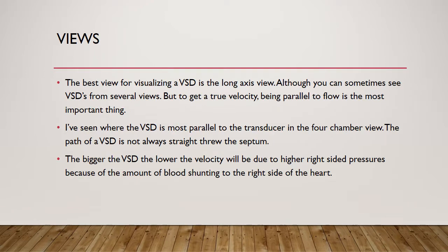The best view for visualizing a VSD is the long axis view, although you can sometimes see VSDs from several views. To get a true velocity, being parallel to flow is the most important thing. In the long axis view, most of the time you're going to be parallel to flow and get the best velocity. You may have to angle the long axis view one way or the other.